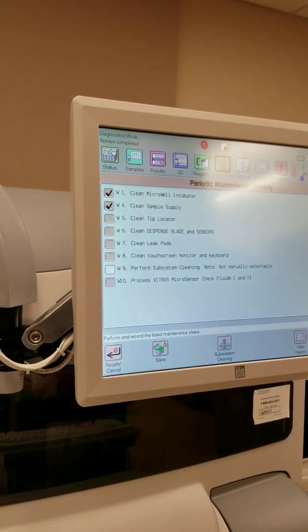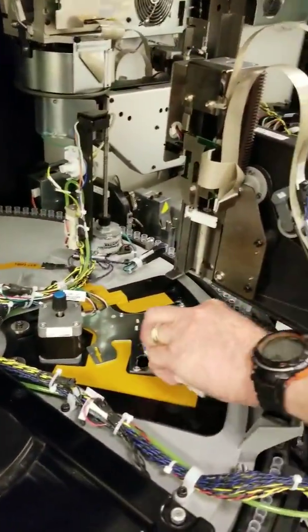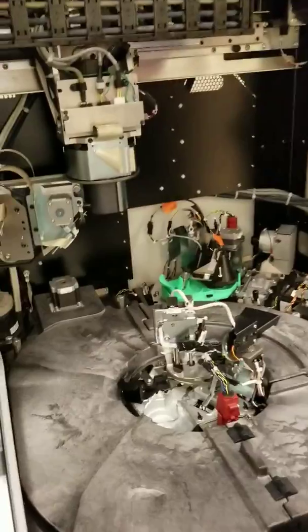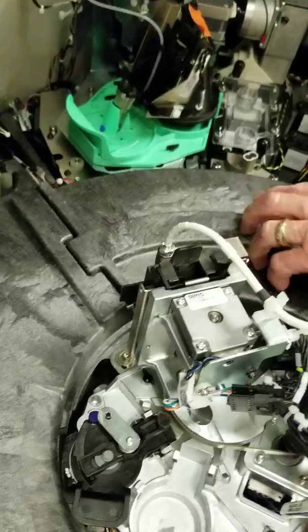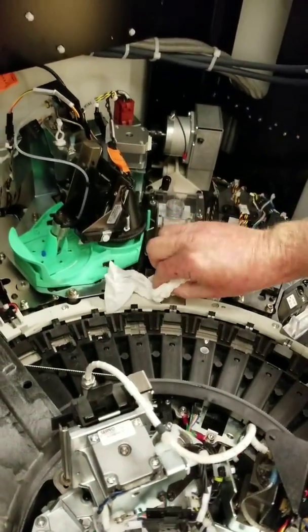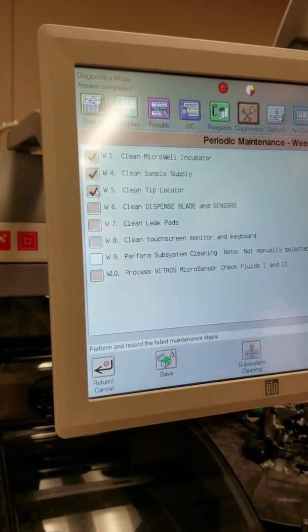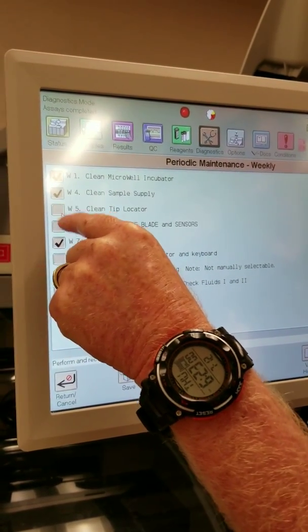Under the left cover there's a leak pad, under the middle cover there's another leak pad, and under the right cover there are two leak pads. Now we can check off clean tip locator and move on to clean dispense blade and sensors, as well as the leak pads that we just did.